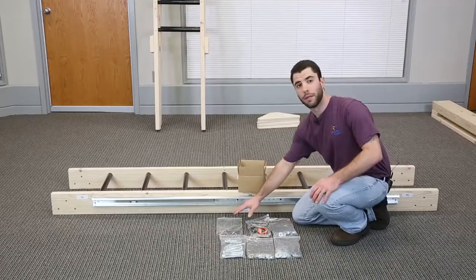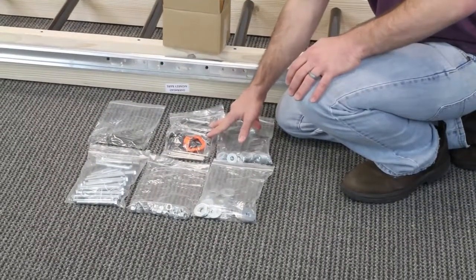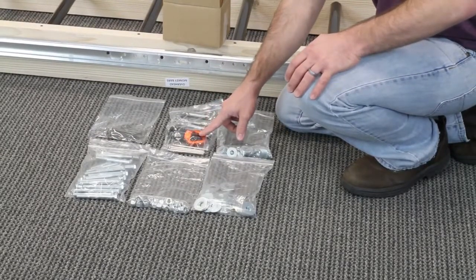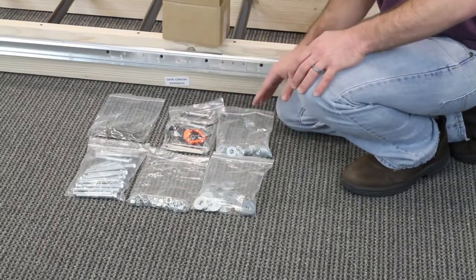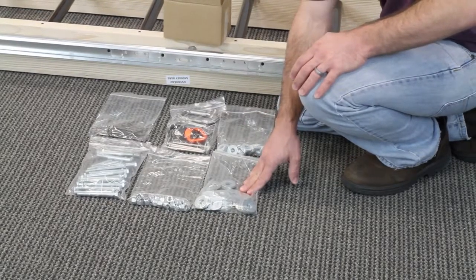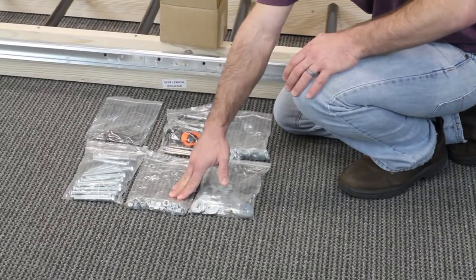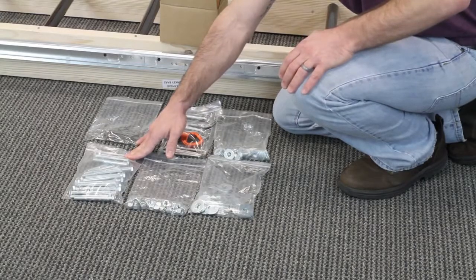Please note that you have 30 2.5-inch screws, 2 safety connectors, 1 heavy-duty rotational device, 4 hinge pins, 48 3/8-inch washers, 48 1/2-inch washers, 24 9/16 nylon lock nuts, and 24 9/16 bolts.